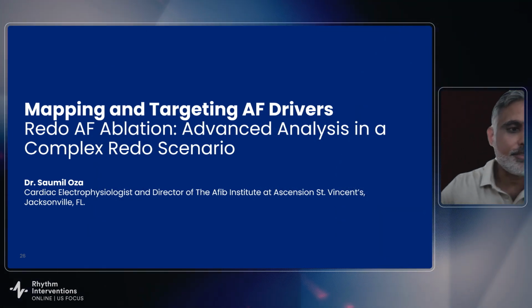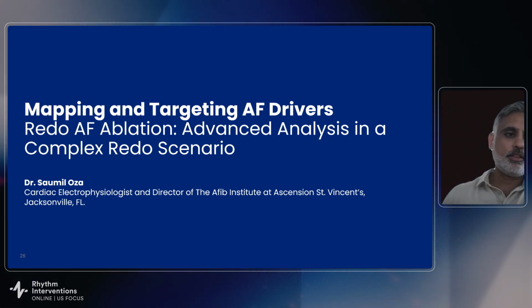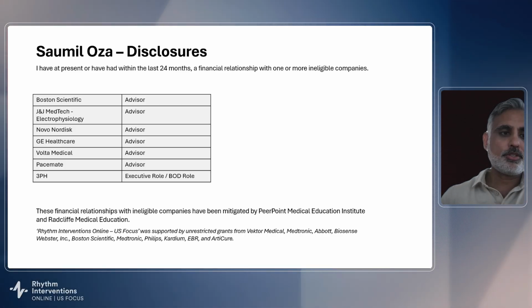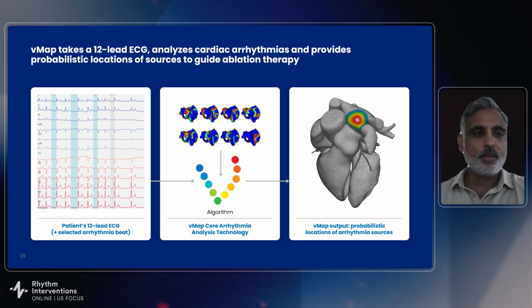So thank you for having me, first of all. I'm going to be talking about mapping and targeting AFib drivers outside of the PVI, particularly in redo ablations. I'll be giving a case of a redo ablation. But first, here are my disclosures, and I'll be talking a little bit about the technology.